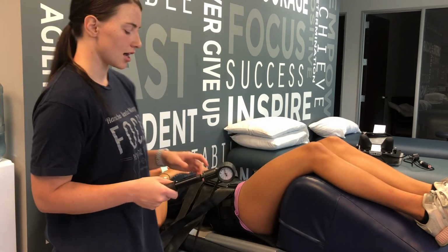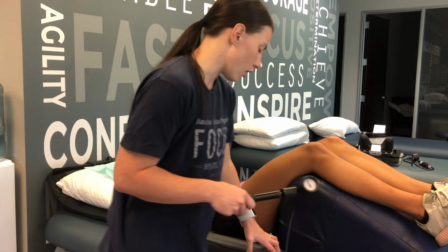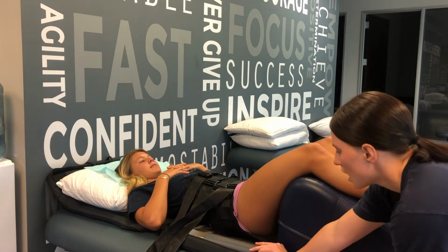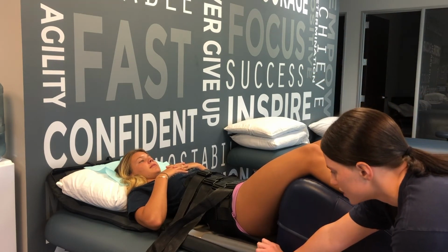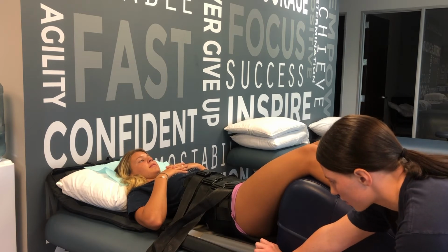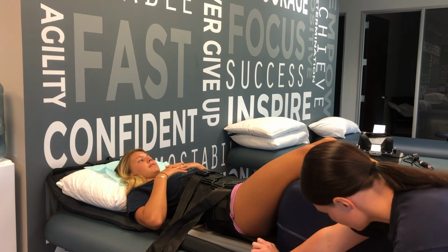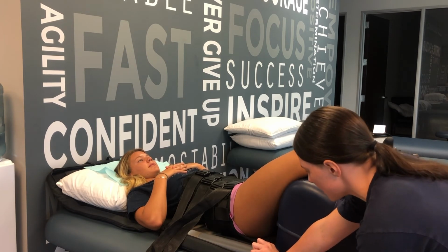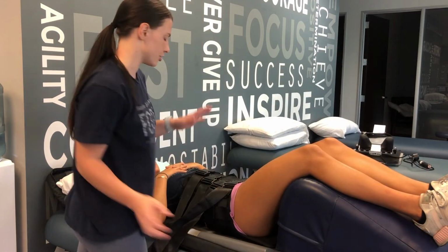You have to kind of let the air pump out for a second. It does take a while to go all the way back to its original position without some help. So just easily, I give it a little bit of resistance there to reset back. And then once it gets pretty close to the top and the air stops flowing out, we can take them off. And so you just take them off in the opposite order you put them on.